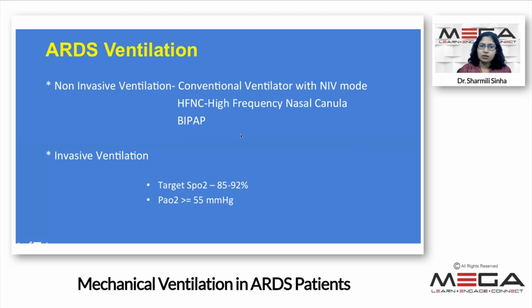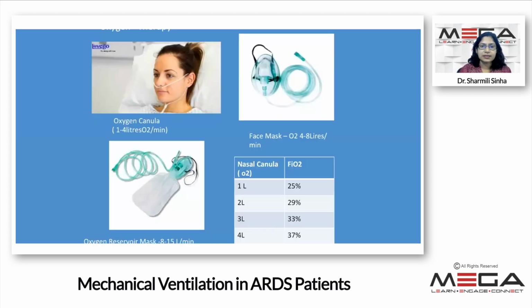In the non-invasive mode, we'll discuss the conventional ventilator, which has an NIV mode, the high-flow nasal cannula, and even the smaller BiPAP machines of different types that were used in these patients in the pandemic. So we'll quickly see that.